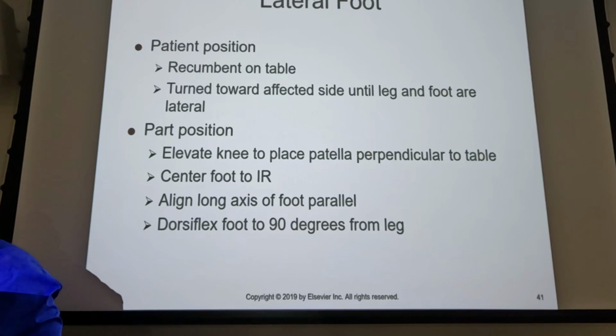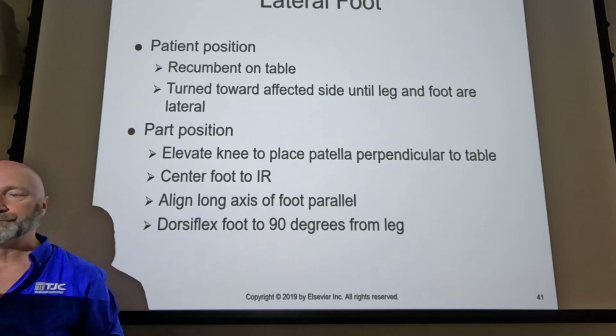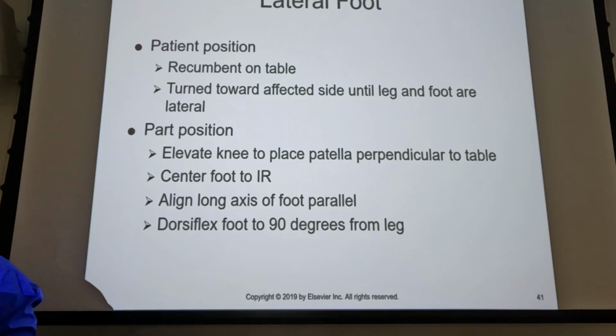Have them hike up on a hip to rotate to the 30 to 45 degree internal oblique. It's always going to be internal oblique for feet. Okay, internal oblique. Medial rotation, internal oblique. You got your oblique. Take the angulation off the central ray, and you got your oblique.